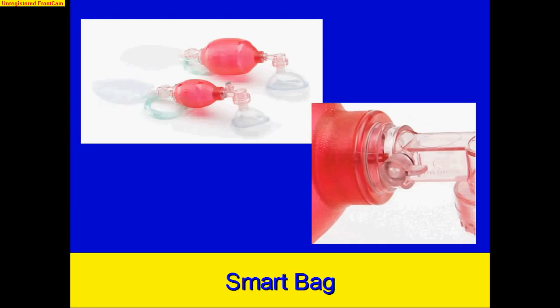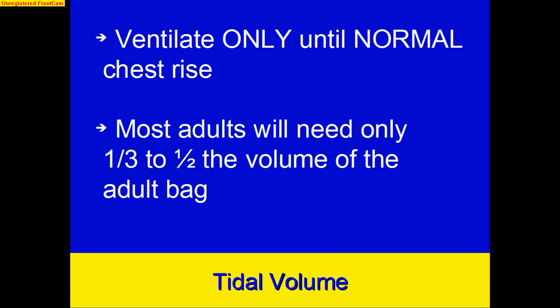So we believe these are an excellent tool. We'll be deploying those soon. And you can see in the picture on the bottom right, there is a switch where you can flip to disable the pressure valve and go back to a plain non-smart bag. But we think these are an excellent tool to help us with proper ventilation pressures.